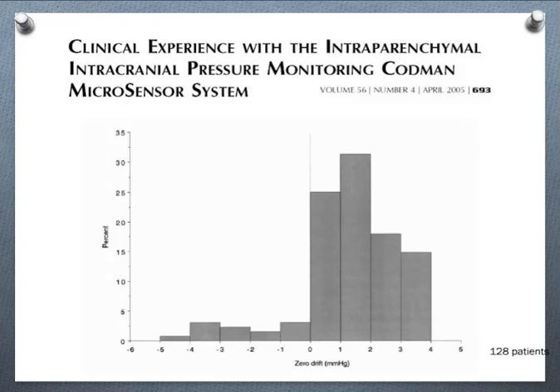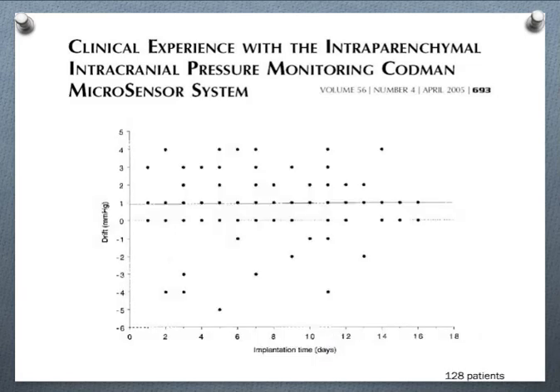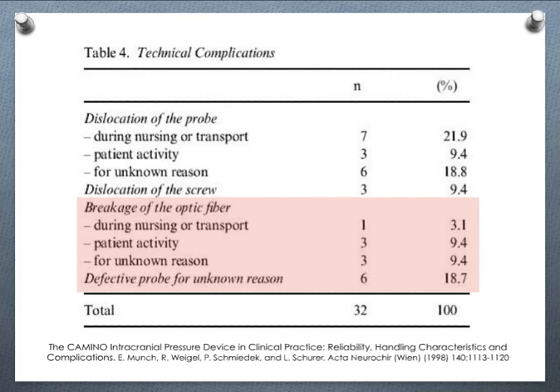If you apply the same concept for the intraparenchymal catheter at the removal, we ask a nurse every time to take a look at the number at the removal of the probe. This has been done in the northern part of Europe, 128 patients. The drift at the end of the life of the catheter is not so huge as expected in the previous paper. And the Bland and Altman plot, in this case, presents after 10 days of use a small difference from the gold standard.